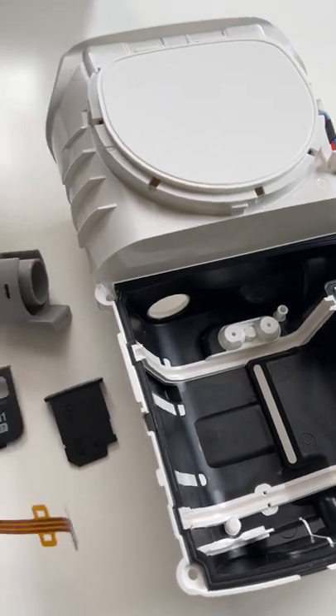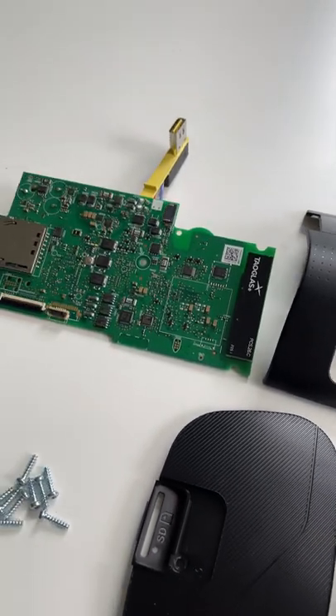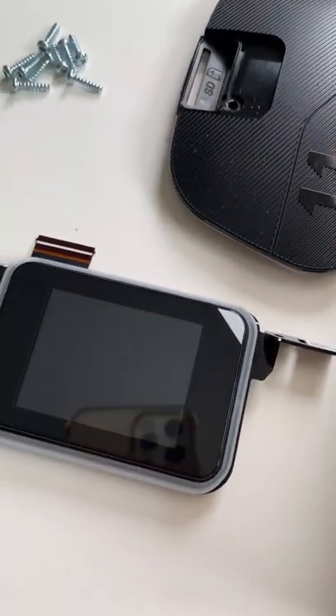Here's the outer casing, PCB board with the new power connector at the back there, and then your new touchscreen.